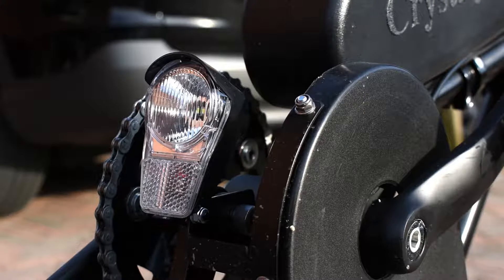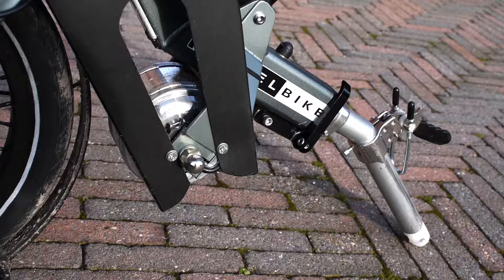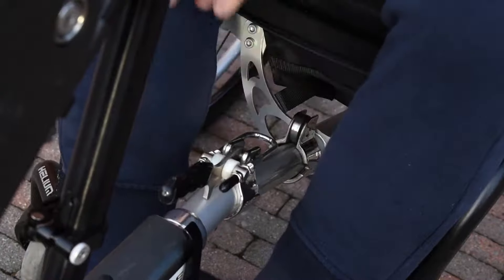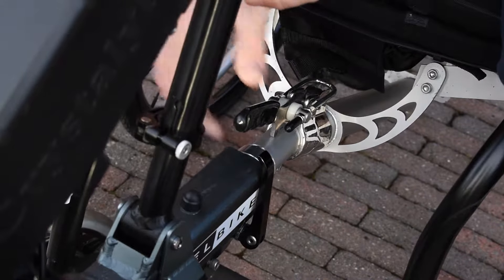The EasyLegs Connect is small and easy enough to take along in the car, and is also easy to store at your home or in the garage. If you already have a hand bike that can be connected to your wheelchair, it's usually possible to connect the EasyLegs Connect via the same coupling to your wheelchair.